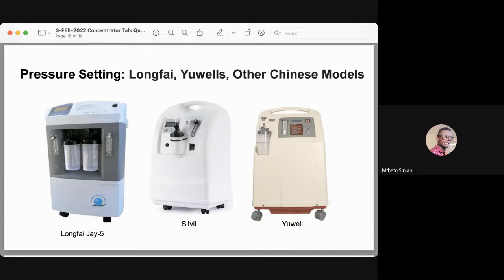The pressure regulator is inside the concentrator under the product tank, so you need to open up the machine to make adjustments. To adjust the regulator, you need to do the following. As usual, first disconnect the humidifier bottle from the patient's outlet, turn on the concentrator, and set the flow meter reading to 2 liters per minute. Connect the pressure gauge to the patient's outlet and make sure the flow meter ball drops down to the bottom after connecting. If the pressure is high, adjust the regulator down to 70 kPa.